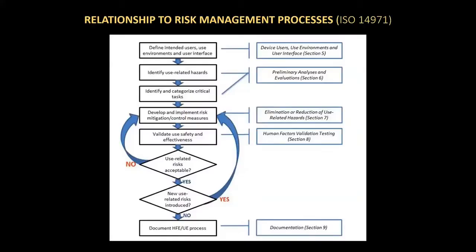So this is a flow chart which is closely aligned to ISO 14971. In all of the work that we do, it's a very similar thing. We're identifying the hazards, establishing the level of that risk. We try to understand the likelihood of that risk happening to develop a risk profile for that particular hazard. Then we define how we mitigate that risk, and then test and report.